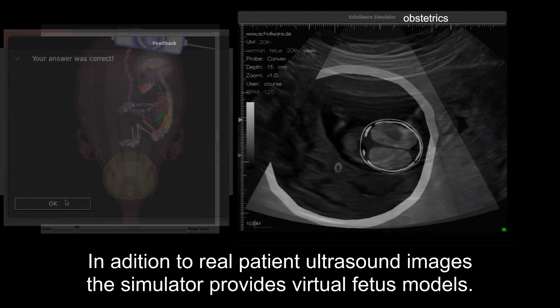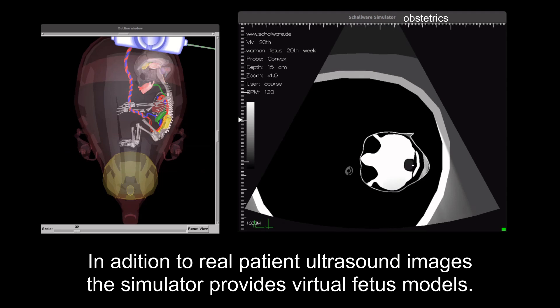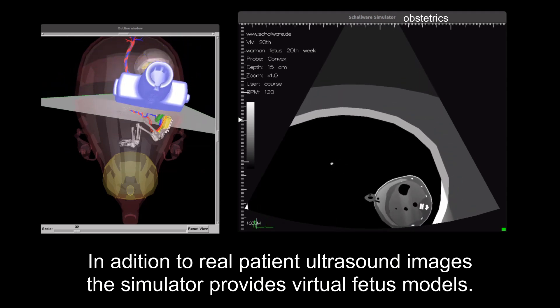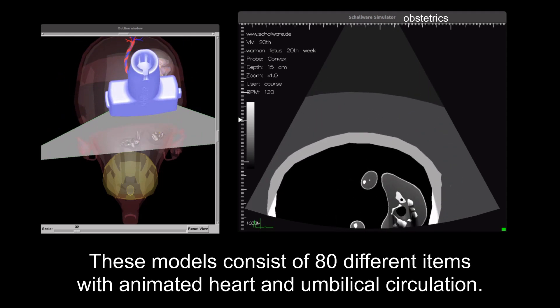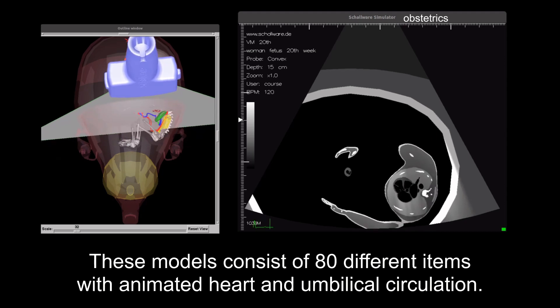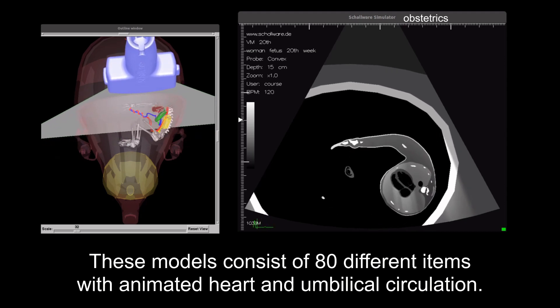The simulator provides real patient ultrasound images and virtual fetus models. These models consist of 80 different items with animated heart and umbilical circulation.